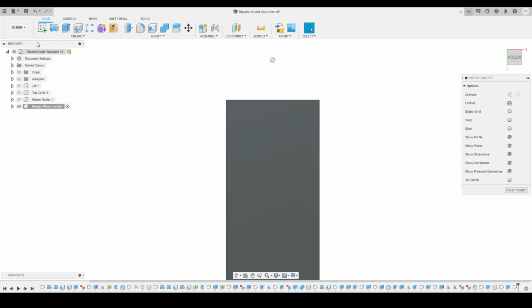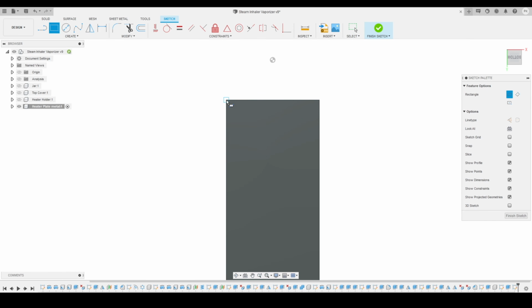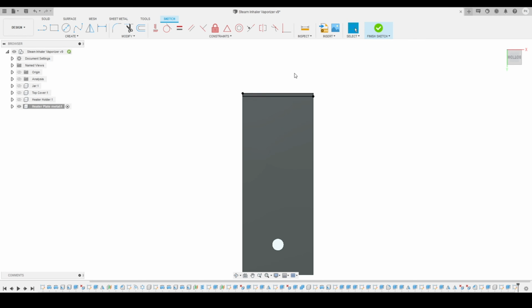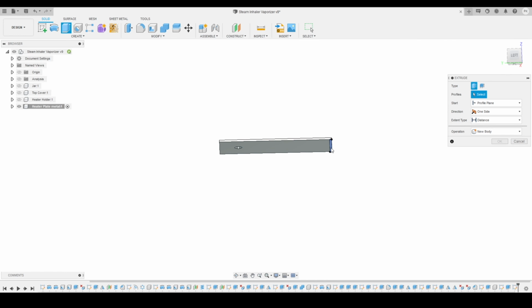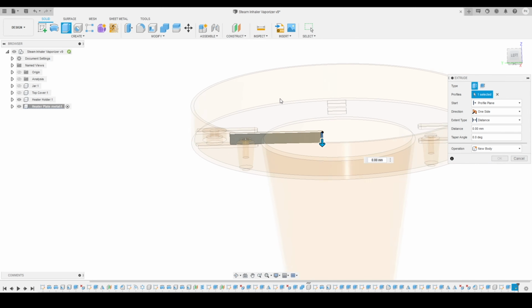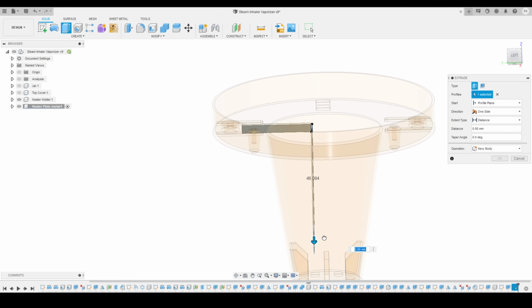We'll select this face and click on create sketch. Now I'm going to create a rectangle on this face. Here you can see, now I will make sure that the thickness is 0.5 millimeters. So we'll give it a distance over here of 0.5 and click on finish sketch. Now I will activate the extrude tool again, select the profile and extrude this up to the bottom.